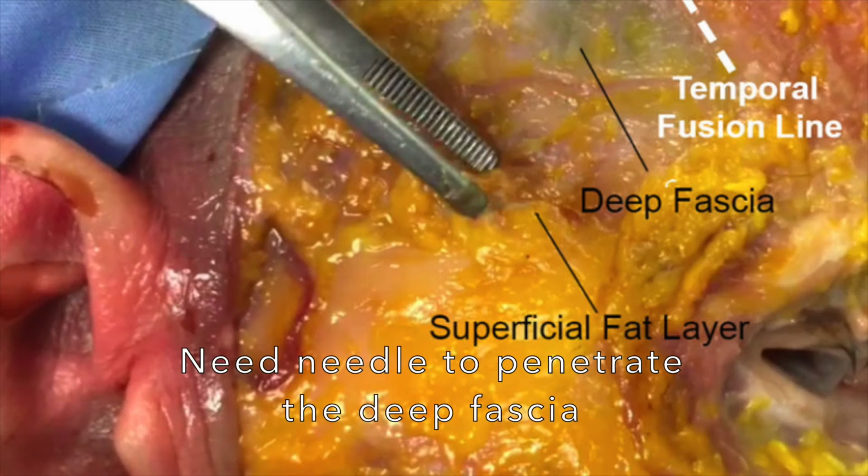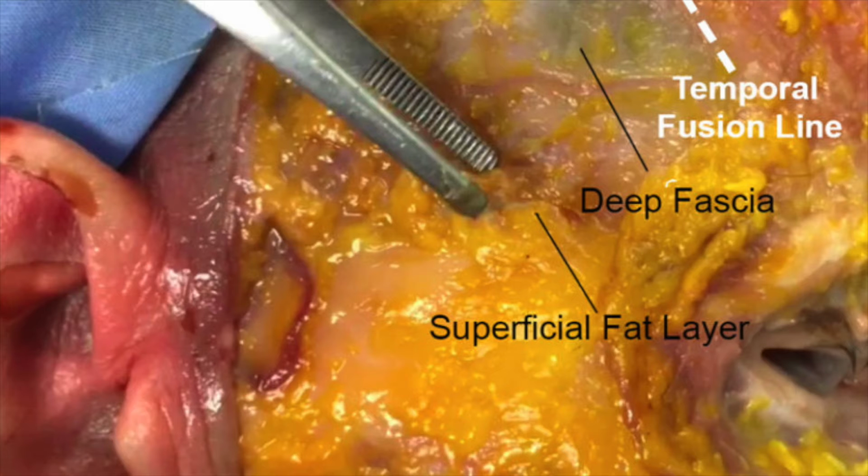The second layer for injection of filler is the subdeep fascial plane. As the deep subfascia is quite thick, penetration is only possible with a needle. The cannula won't be able to penetrate the deep fascia. This is my favorite layer as it gives a smooth and gentle lift. It requires less filler compared to the supraperiosteal plane, which is much deeper, but it will require more filler than the superficial fat plane. Aesthetically, this gives the best result.